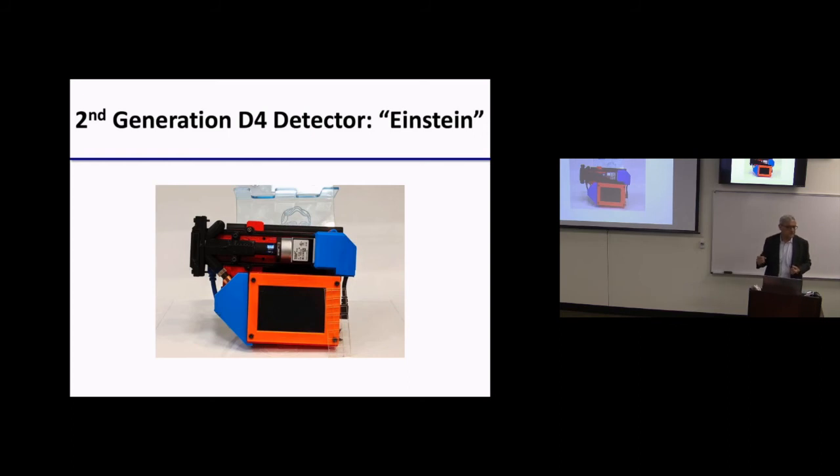The biggest expense is actually that the filter's massively expensive, and then it's the computer and the CMOS sensor. This is buying like 1 or 2 parts at a time. If you were to buy 10,000 of these, I think we can drop the price down to a few hundred or $100 because they're charging retail prices one at a time. And if you go to Sony and say I want 10,000 of these, I think they would give us a better price. But even $750 is not bad.